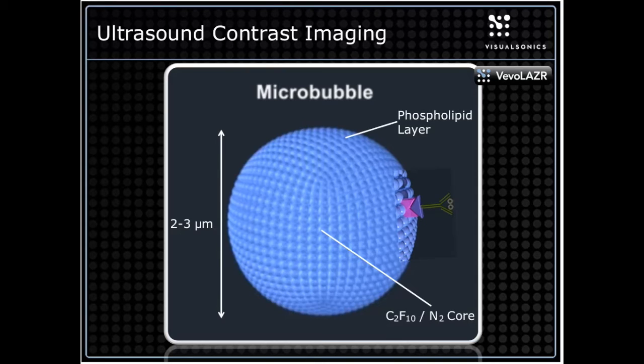If you want to look into the capillary flow, contrast agent at the size of erythrocytes, meaning the contrast agent does stay vascular, does not diffuse into tissues. You don't need to correct for diffusion parameters. And you can also use this contrast agent for molecular imaging. So the insert on the right is not drawn to scale, but you can use antibodies to label your bubbles or contrast agent for detecting endothelial surface markers.